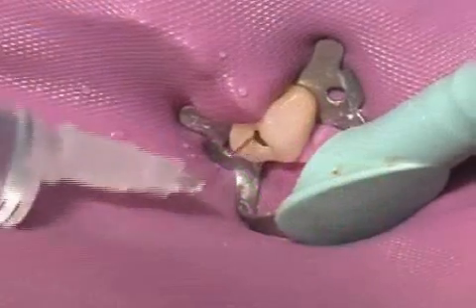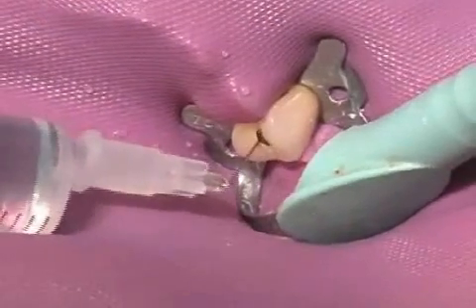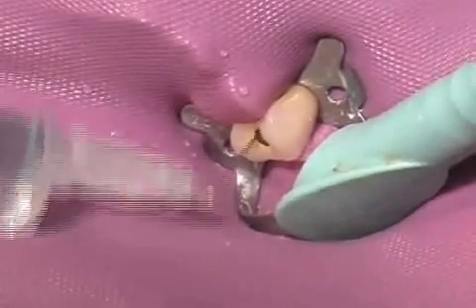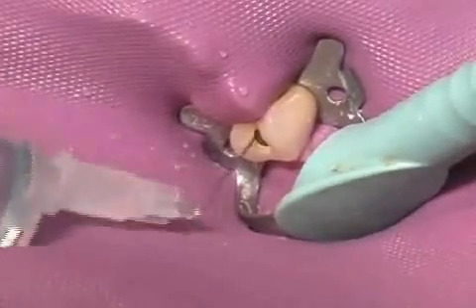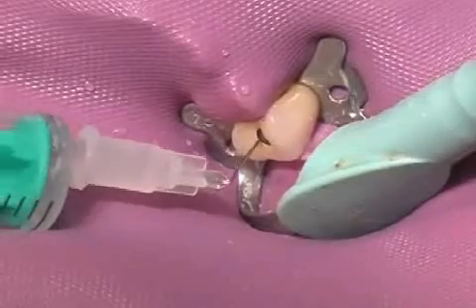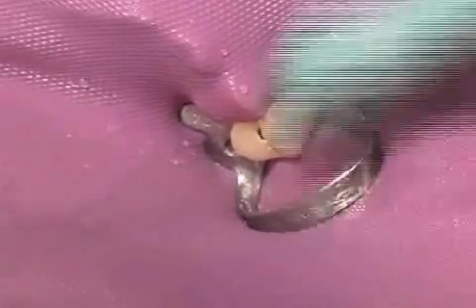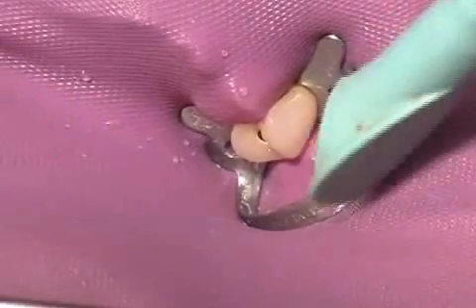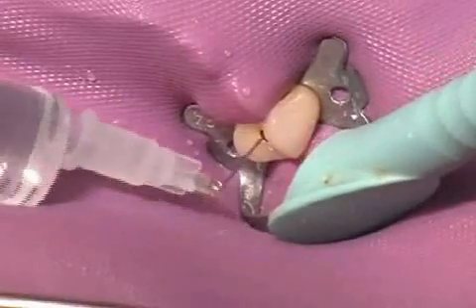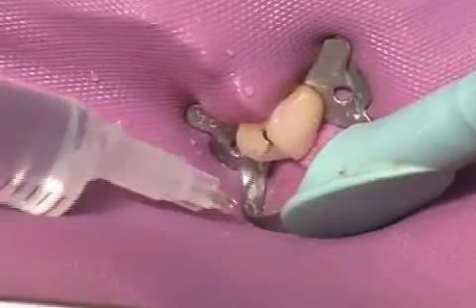Here you see a tooth whose canals have already been reconditioned. The work area is protected from saliva and the tongue by a cofferdam. The cofferdam also prevents the patient from swallowing the chemicals, in this case the NaOCl. Now the canals are rinsed with sodium hypochlorite.